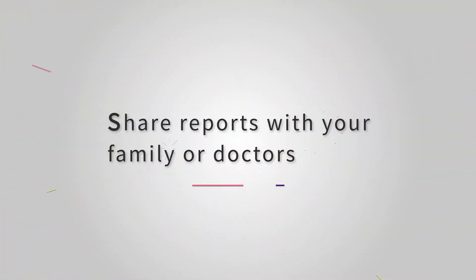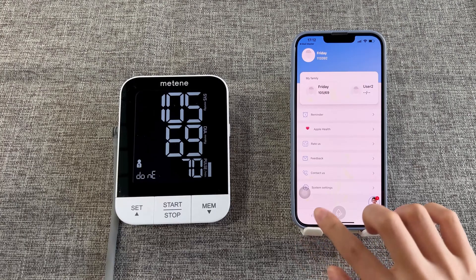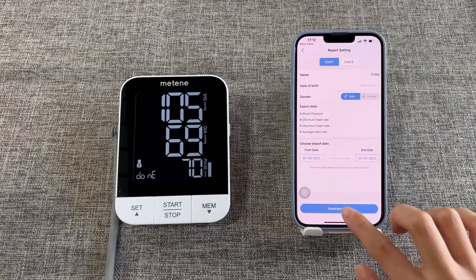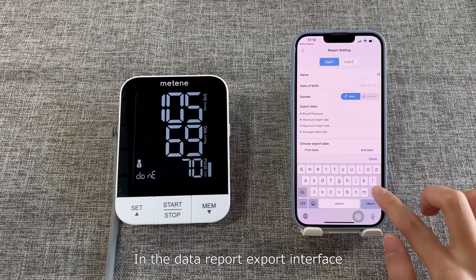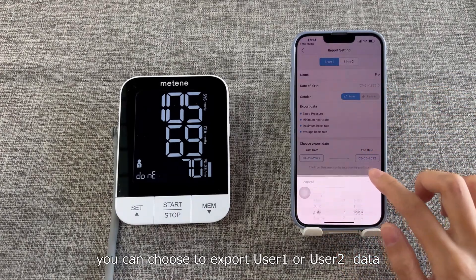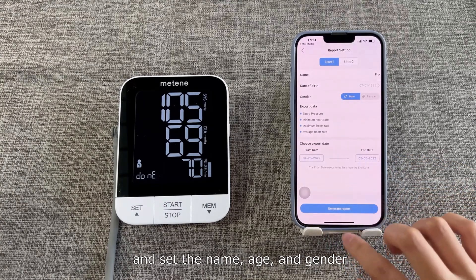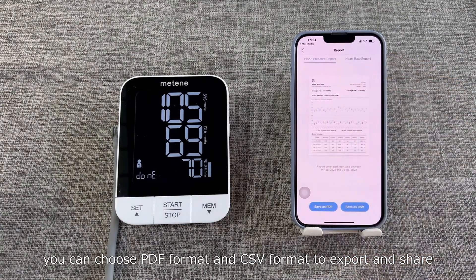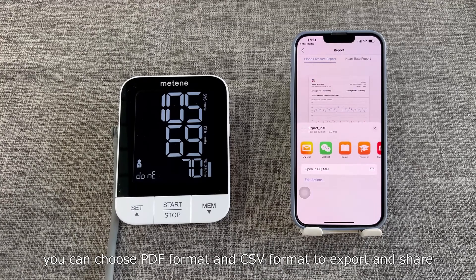Share reports with your family or doctors. In the data report export interface, you can choose to export user 1 or user 2 data, and set the name, age, and gender. After selecting the date you want to export, you can choose PDF format or CSV format to export and share.